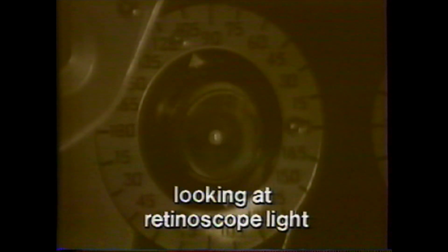Here we are retinoscoping a patient without drops and suddenly the pupil constricts and the reflex changes. What happened? The patient looks directly at the retinoscope light. Redirect his attention to the end of the room. That's better.